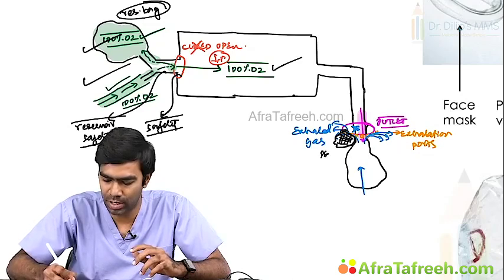Near the exhalation port, I can put a PEEP valve. So PEEP is positive end expiratory pressure. How will it generate a positive end expiratory pressure? Because during expiration, you are generating a positive pressure. I'm talking about normal lung recoil. Normal lung recoil itself will produce a positive pressure, as we have studied in physiology. Obviously, why do they produce positive pressure? To push the air out of the lungs so that they equilibrate to the atmospheric pressure.